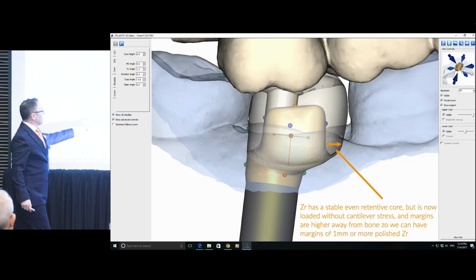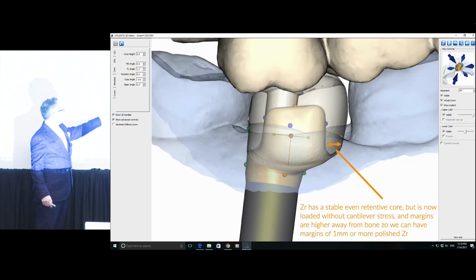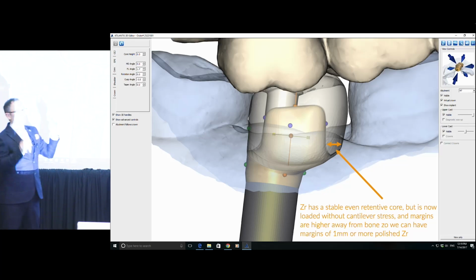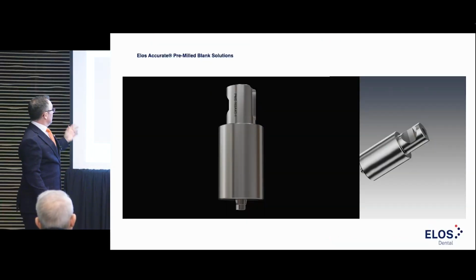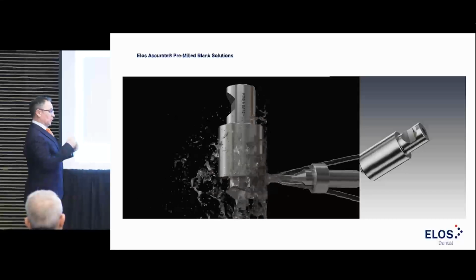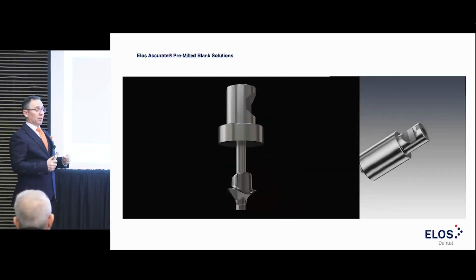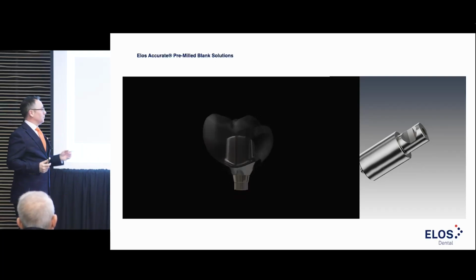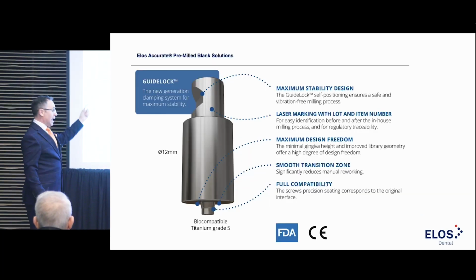So, why am I doing it? Well, we saw where the other ones failed. I'm using the stronger titanium to make sure that we're actually negating that kind of cantilever load away. And this is just zirconia's even thickness all around, more passive. Good bonding area. And this is only really feasible for us because this pre-mill is so accurate. Why is it so accurate? You know, all pre-mills are accurate because they didn't just do the abutment, they actually looked at everything.